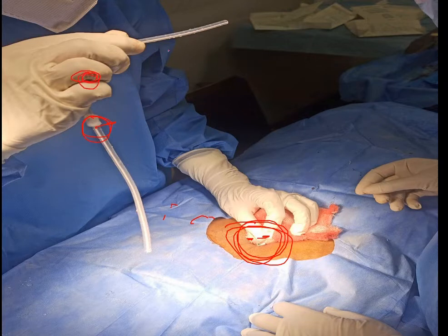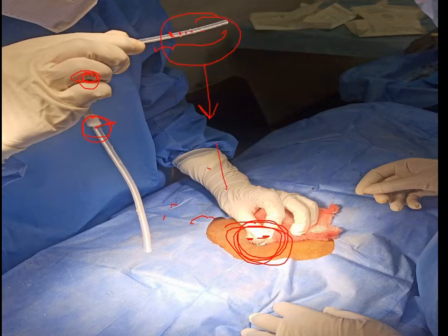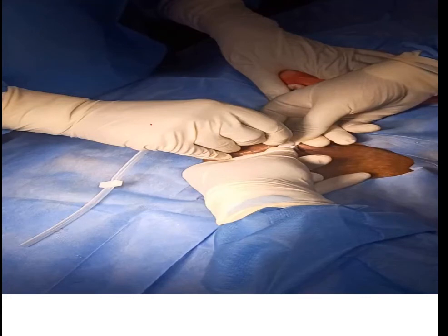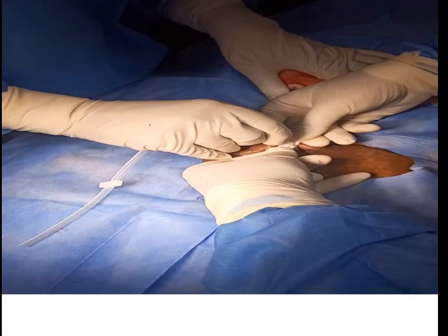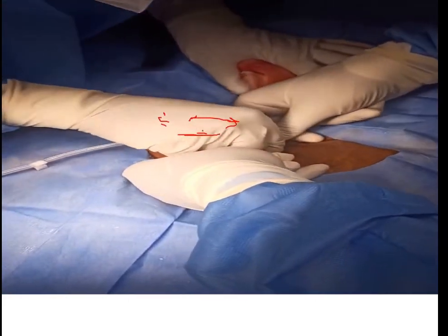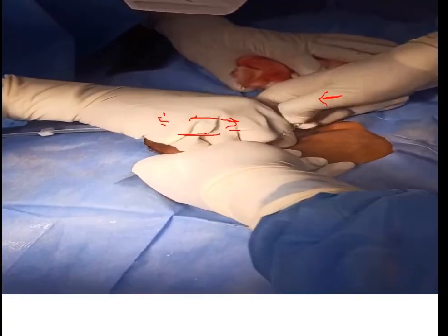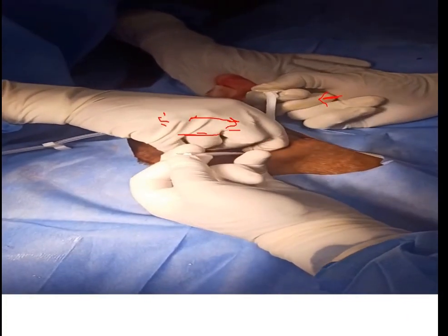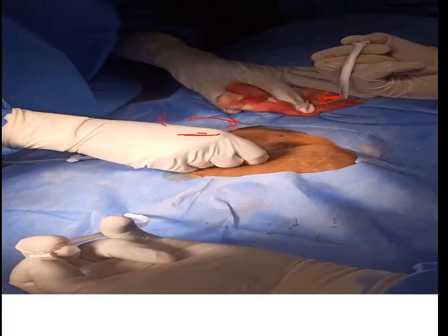Now we take the Tenckhoff catheter: the first cuff is visible at one end, the second cuff further along. We visually confirm the location of the pores — the pored end goes inside through the peel-off sheath. One person inserts the catheter through the peel-off sheath while the other splits and removes the peel-off sheath, similar to permcath technique. The catheter must be held stiff, and the first cuff should remain outside during this maneuver. Then the peel-off sheath is fully removed and the catheter is now inside.